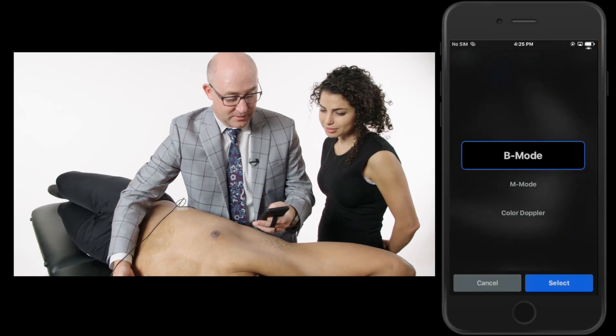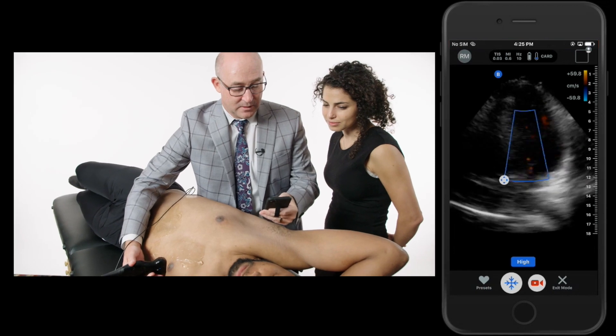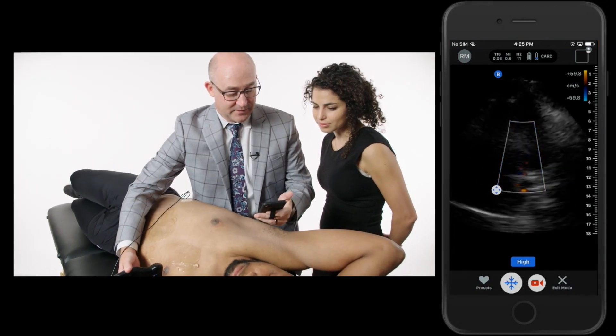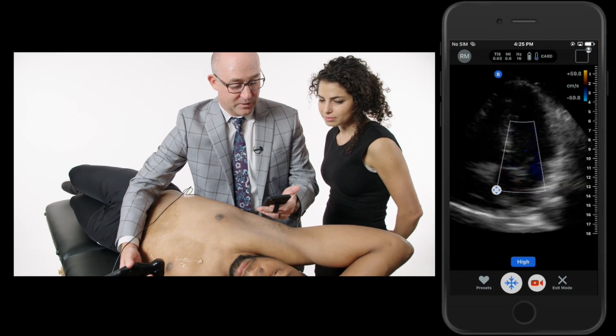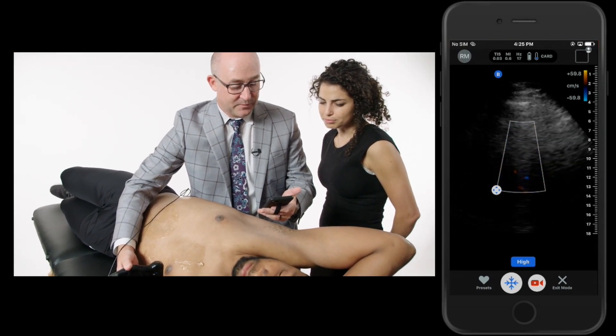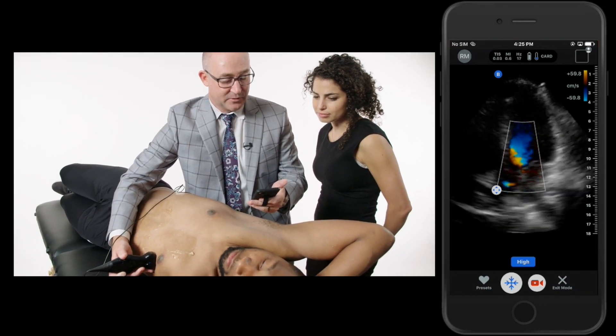Just to demonstrate the fact that we can do color — I get the color question all the time — I'll drag that color right over that aortic outflow track. You can see that blue jet as he breathes in and out. Go ahead and breathe out. You can see that blue jet go right down that aortic outflow track.